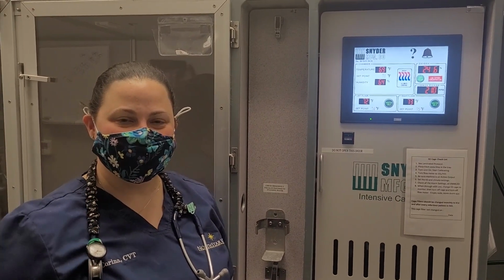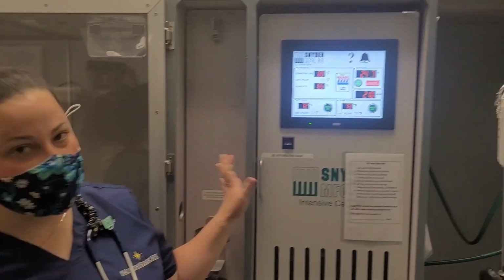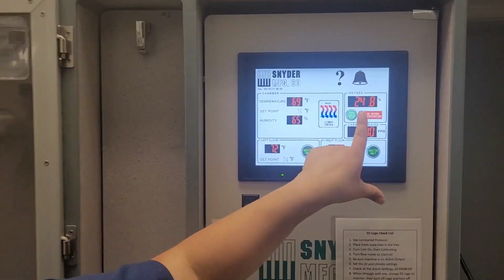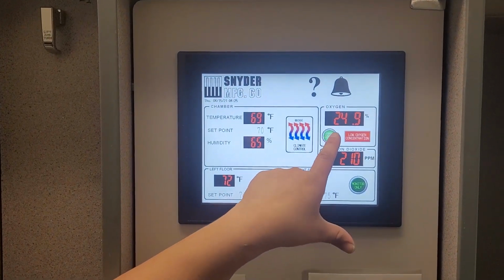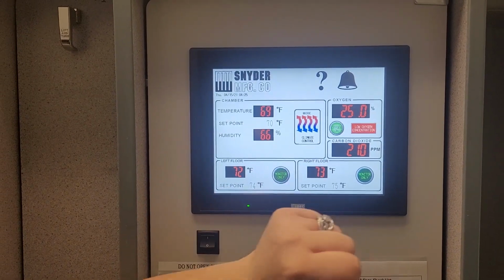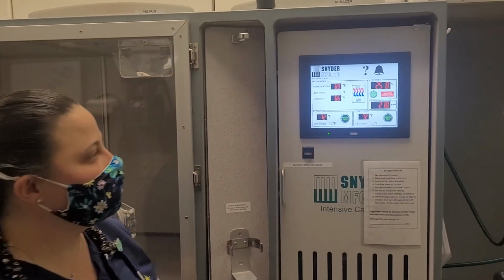Here's some tips when you're troubleshooting your oxygen cage. Alright guys, so we're going to try to make a fake leak in our cage. So if your oxygen percentage is not climbing to where you want it to be, this cage is going to be going up to 40%. If it tends to start to drop, let's see if we can make it drop.